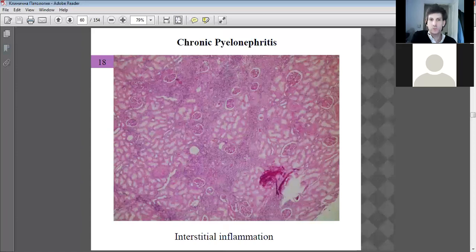The chronic condition as well: inflammation is massive. All these purply dotted bits are inflammation. Big spaces forming. Some of the tubules are still okay, but what I noticed mostly is the shrinkage of the glomeruli starting to shrink. This is more of a normal size. Breakdown of the ball of capillaries. So yes, very, very inflamed tissue overall.